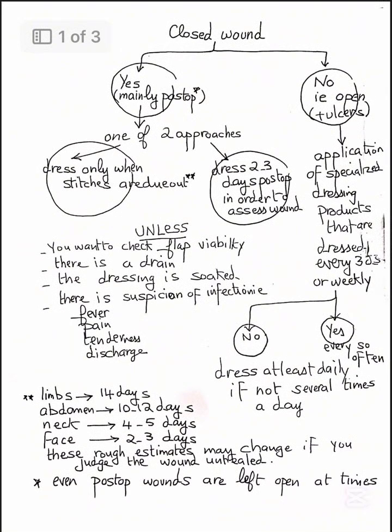Let's explore the fundamentals of tubes and drains in surgical care. First, we start with the basic measurements. The size of the cannulas is typically described using the gauge system, or G. The gauge number inversely indicates size. A higher gauge means a smaller diameter.